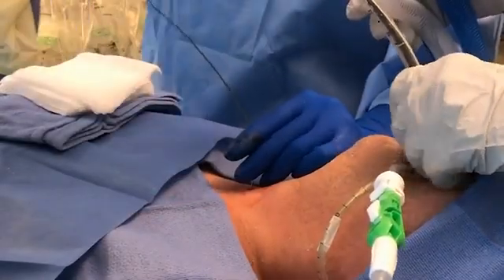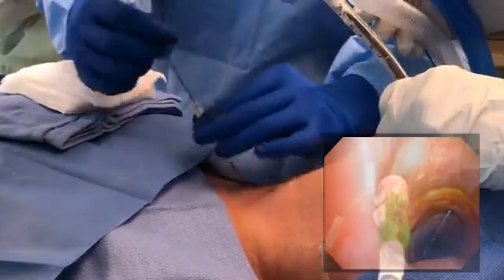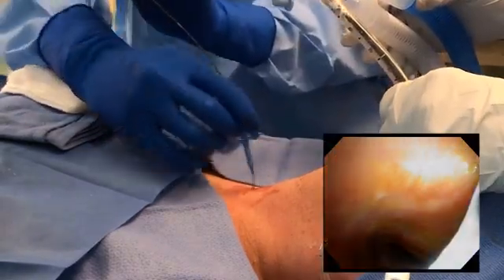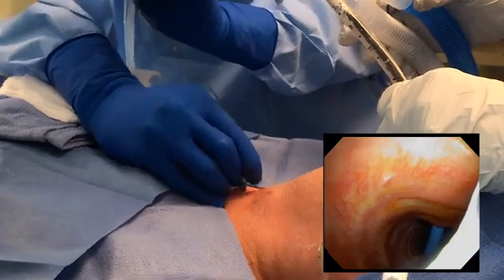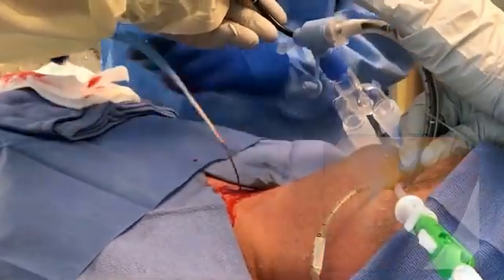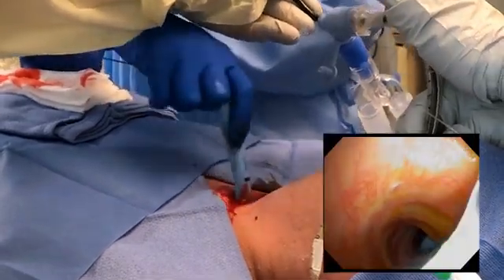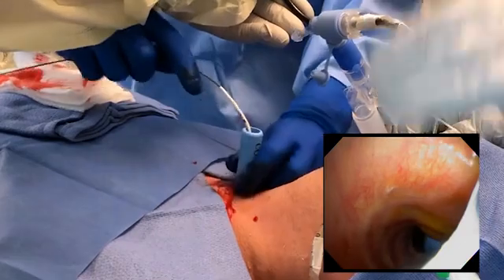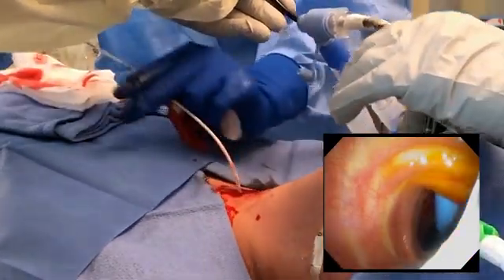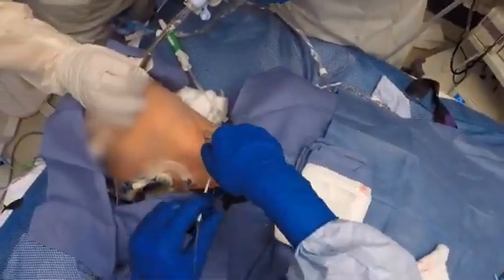Feed the guide wire through the needle and visualize it while advancing it distally toward the carina. Remove the needle over the wire, keeping the wire in the trachea at all times. Advance the small tracheal dilator over the wire to dilate the tract. Remove the small tracheal dilator and advance a single-stage progressive dilator over the wire with the protective sheath loaded. Remove the progressive dilator, keeping the wire and protective sheath in place.